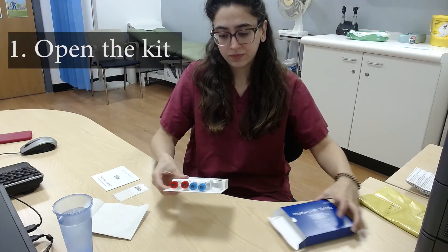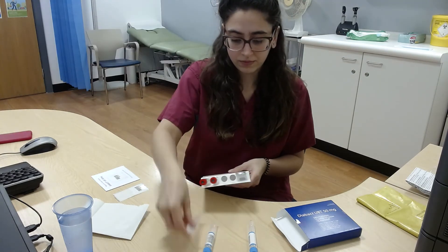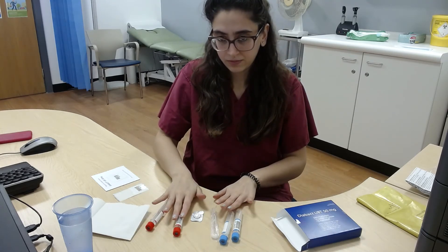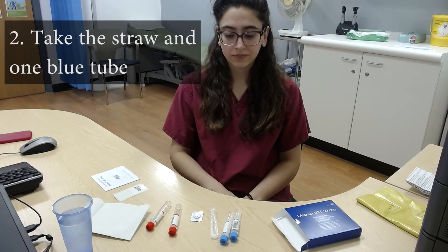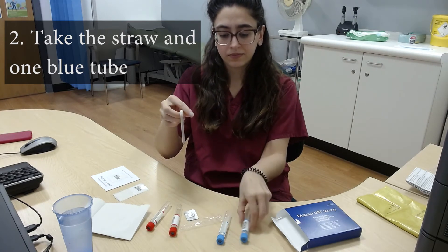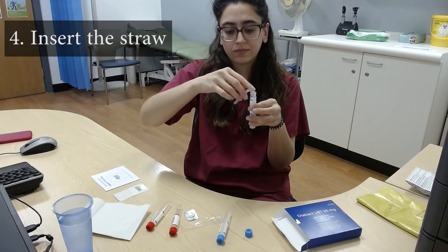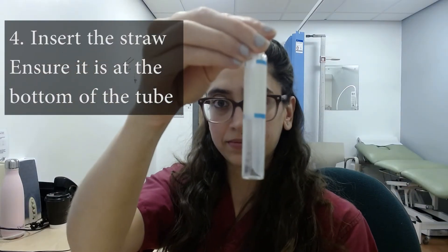To do the test, open the kit box and arrange on the table as shown here. Take the straw and one of the blue tubes. Remove the screw top and place it to one side. Insert the straw, ensuring it goes all the way to the bottom of the tube.